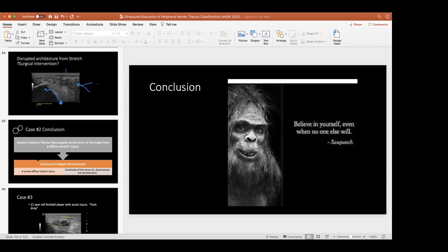For example, when you're talking about the dorsal scapular nerve, which is usually trapped underneath the levator scapulae and really outside the serratus posterior superior, for nerve entrapment there you can compare the serratus posterior superior on both sides, and also the levator scapulae on both sides, and then scan the two nerves on both sides and compare them. You're also talking about the fascia within those muscles, outside and interlinking those muscles together. That's one way to do that. And of course, you can use ultrasound to press on the structures you're looking at.